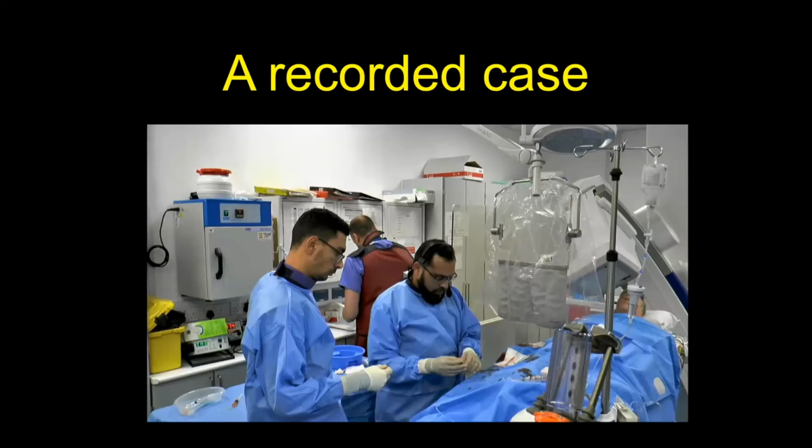And usually, if you didn't stent it at that time, you got good flow. I think the main thing is to achieve good flow. That is the main thing to achieve in all of these cases, even if you put a stent and your flow was suboptimal. That's my view for the thrombosis. If you have achieved good flow, then the body's own TPA works absolutely fine.